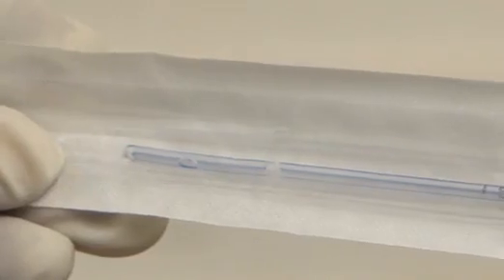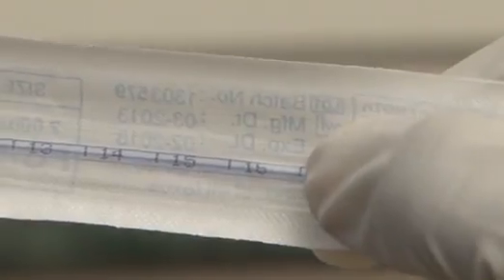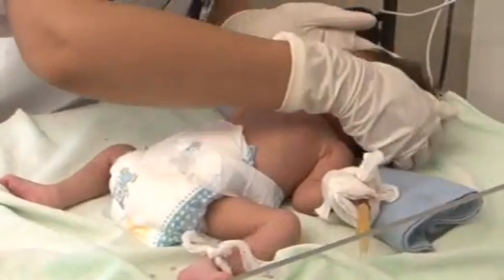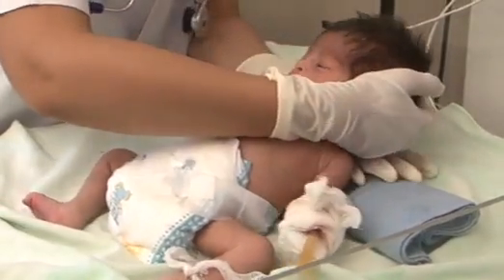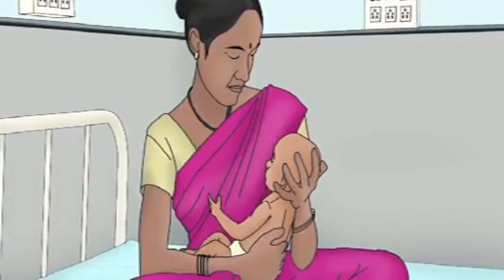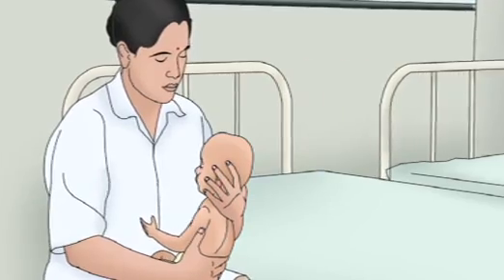Remember this length of the measurement by noting the graduated marking in centimeters shown on the tube. Position the baby in the supine position or on the right side with head elevated, or the baby may also be held in an upright position in the mother's or nurse's arms.